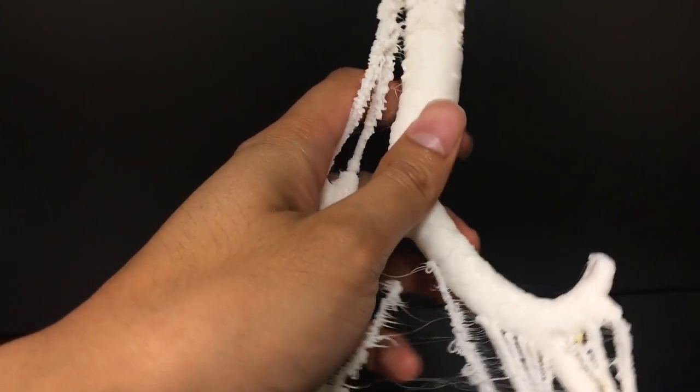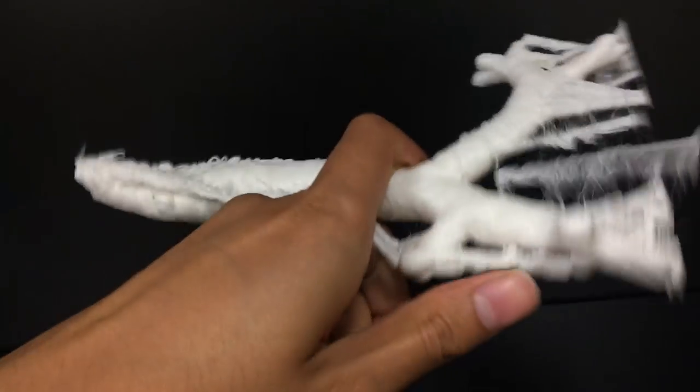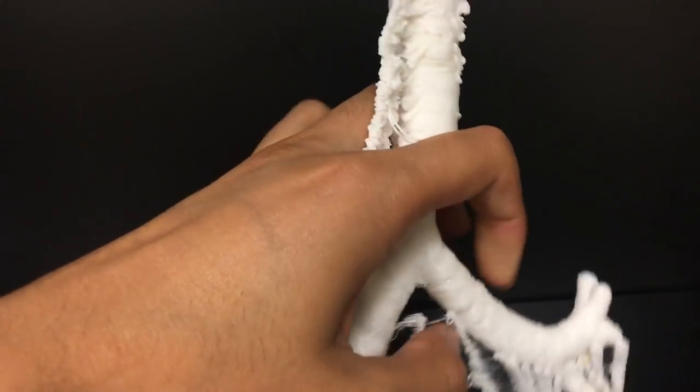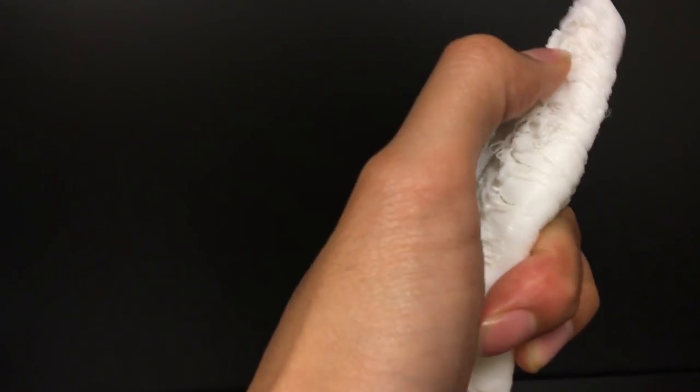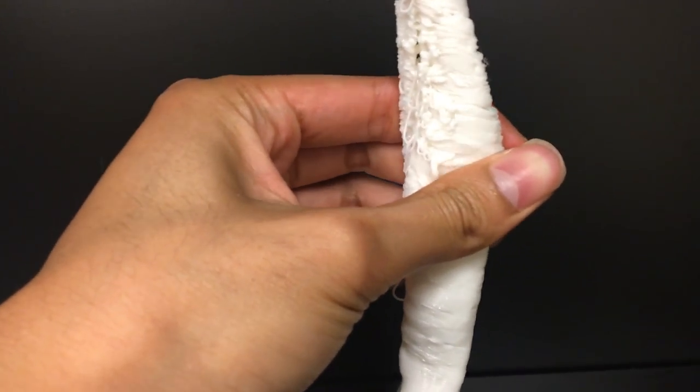So with the NinjaFlex, as I showed off earlier, it is extremely flexible, so we can bend all of the different bronchi, or all the airways. It's very difficult to actually get consistent lighting in here. I'm sorry. So yeah, very flexible. Squeeze it, and it's pliable.